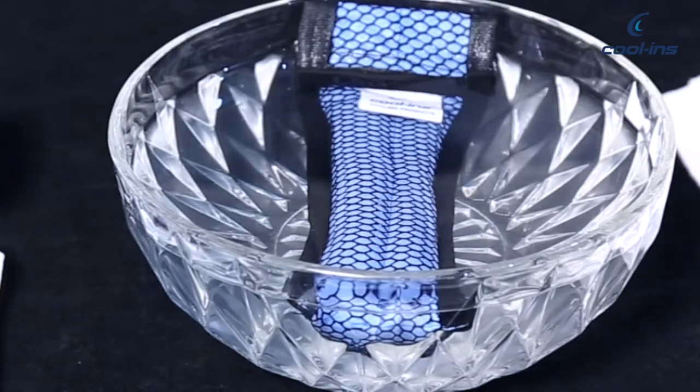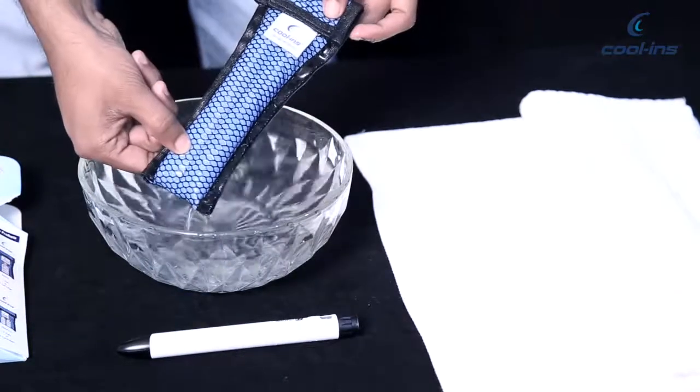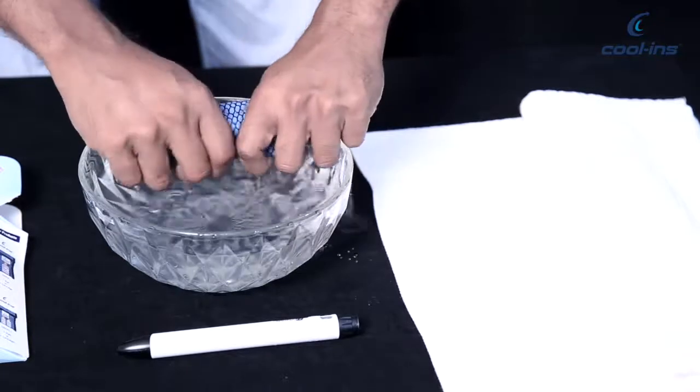You will notice the panels will expand. When the panels have completely expanded, take it out of the water. Squeeze gently to drain excess water from the pouch.